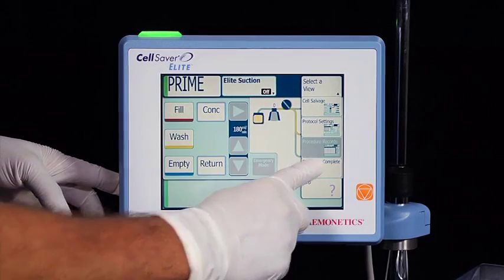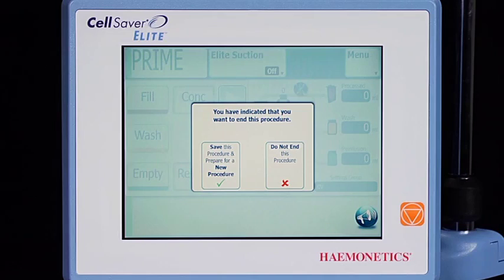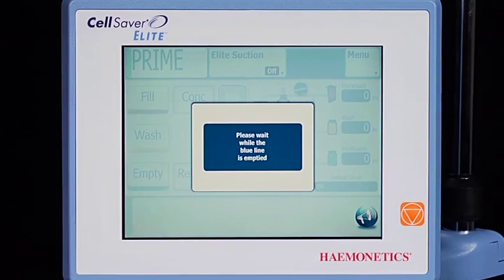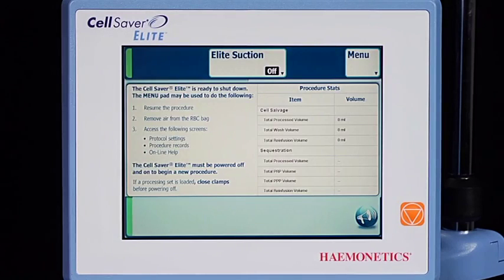When Procedure Complete is selected, the device will first give the user a choice. If Do Not End This Procedure is selected, the device will return to the previous screen. If Save This Procedure and Prepare for a New Procedure is selected, the device will automatically empty the blue line, then take the user to a Procedure Summary screen.